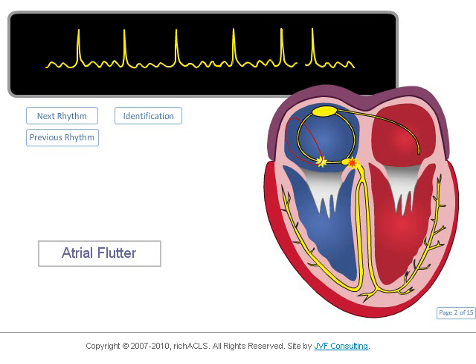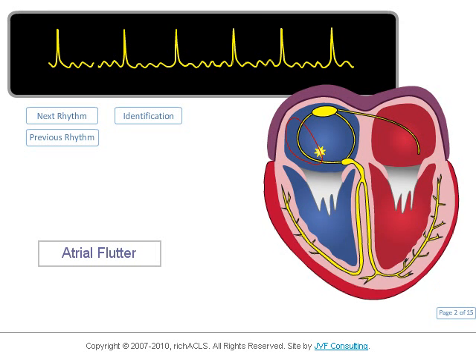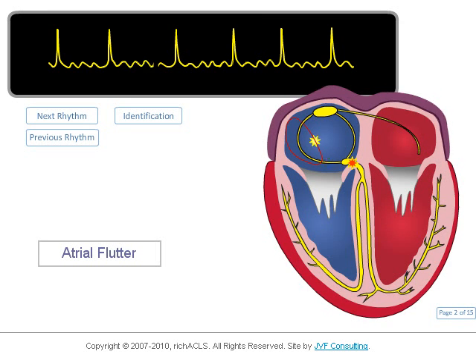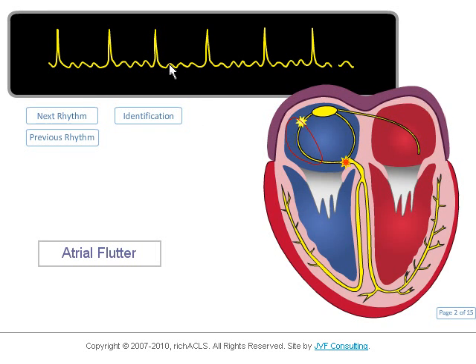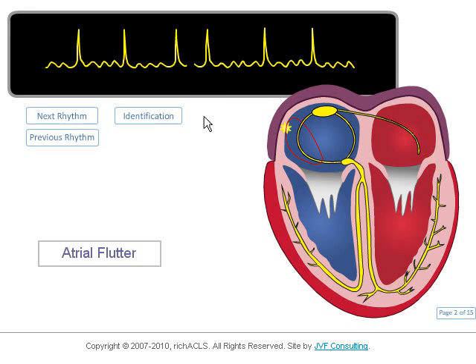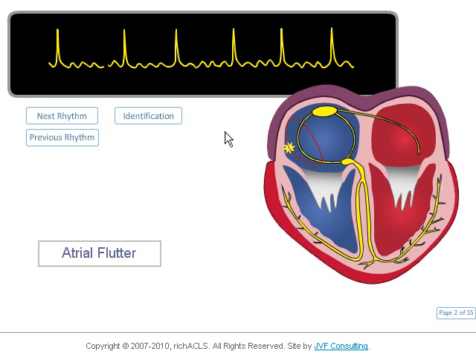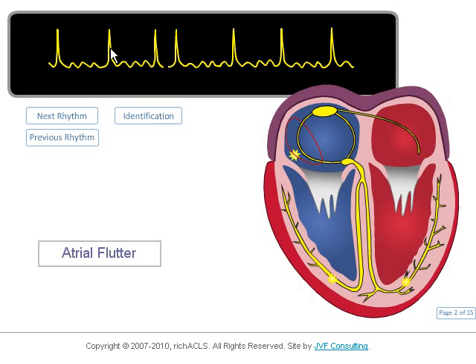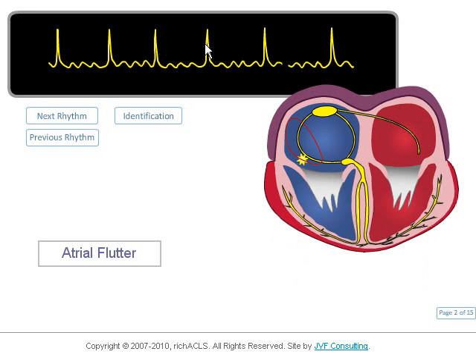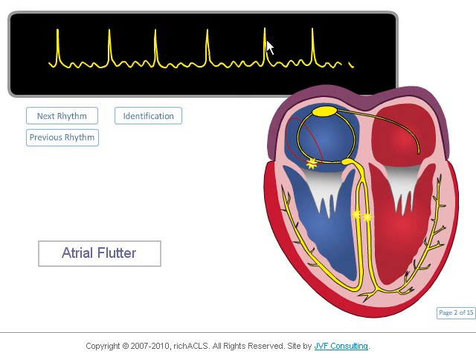This rhythm, atrial flutter, also has a unique waveform. We see what looks like many P waves, but they are actually F or flutter waves. The QRS is narrow. The R-to-R intervals are fairly regular but will vary.